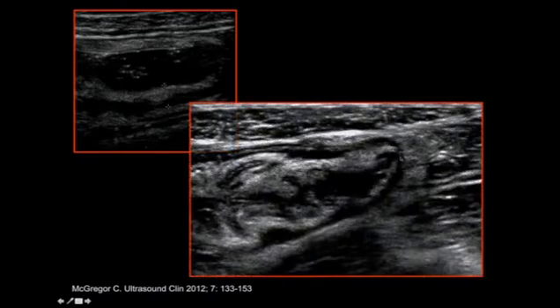This is much different than this patient that has Campylobacter colitis in the right colon, so her cecum is inflamed because of infection, not because of appendicitis, and now the pattern of bowel wall thickening is much different. The thickening is circumferential, involving all walls equally, and the thickening is centered more on the inner layers than the outer layers.